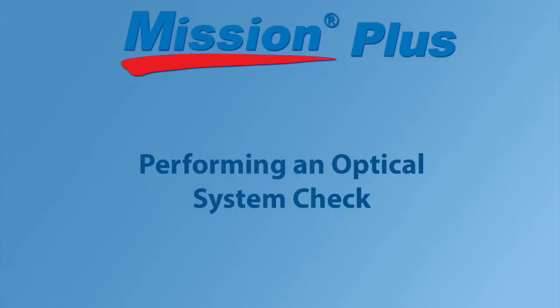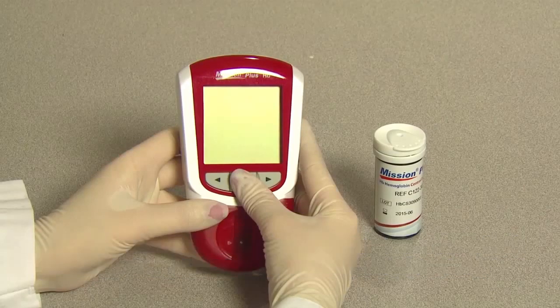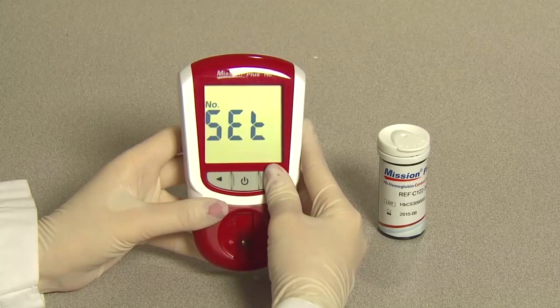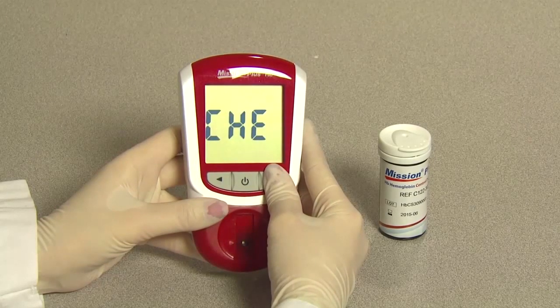Performing an optical system check. The optical system check is performed to ensure that the meter's optical system is functioning properly. To perform an optical system check, press and hold the power button for 4 seconds to enter the setup screen. Press the right button to navigate from the setup screen to the optical check mode, CHE.